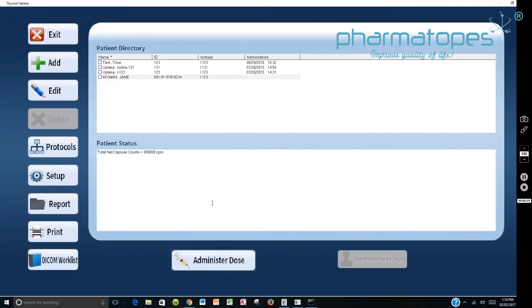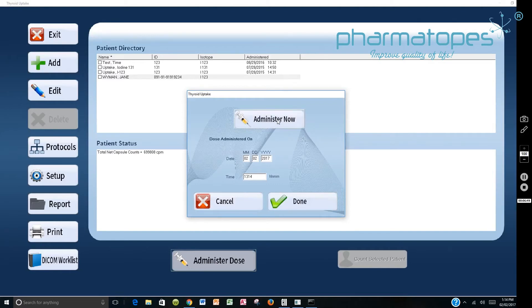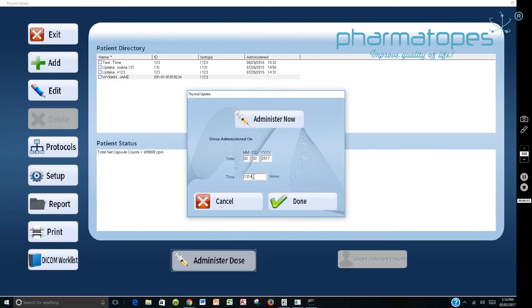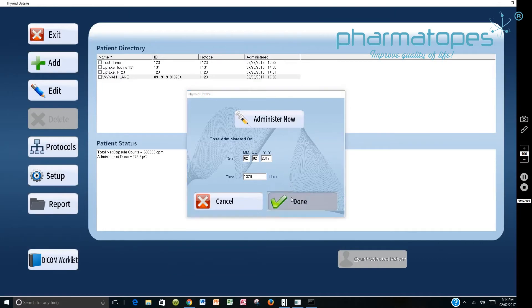Now you have the opportunity to administer the dose. So in this case we're going to say administer dose. And we select administer now. And it'll enter in the current date and the current time. And if that's an acceptable one, you can do that. In this case we're going to say we're actually administering this at 1320. So I would backspace and put in 20, 1320 and say done.